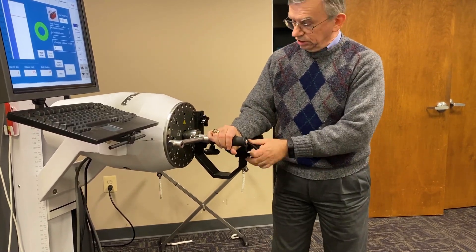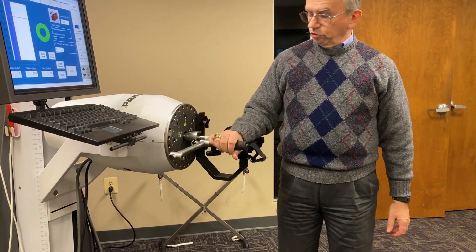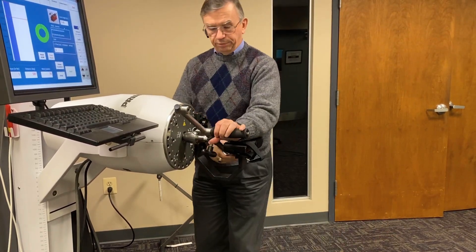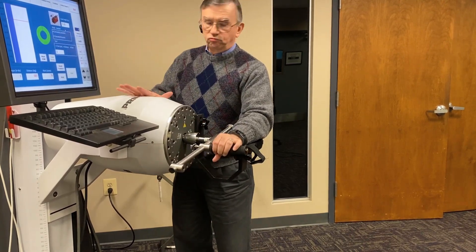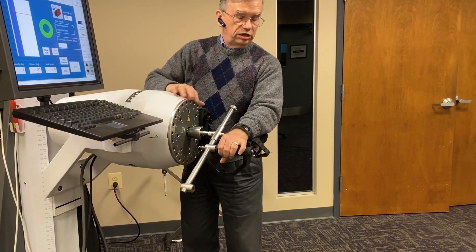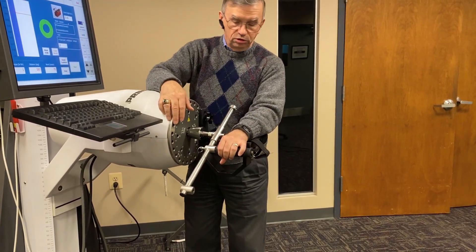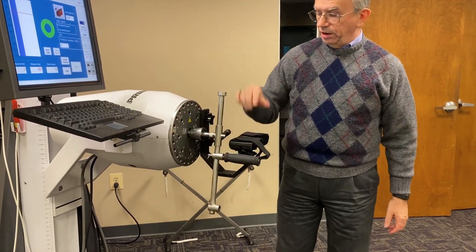Normally I strap the arm down, but I'm just not taking the time to do that. I'm going to stand this way for the right, and then I'll be able to step across here to do the left. Just don't let them rest their hand up here because they'll use it for leverage. That way you don't have to move the armrest to either side — it's a matter of which way you want them facing, and they can just step back and forth.